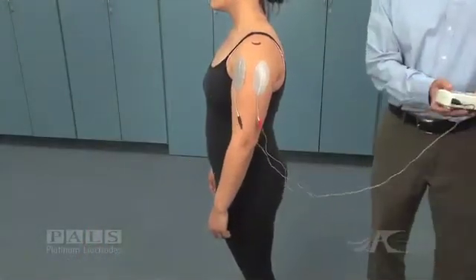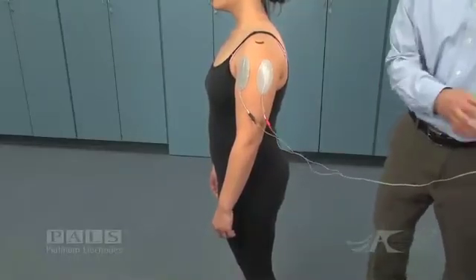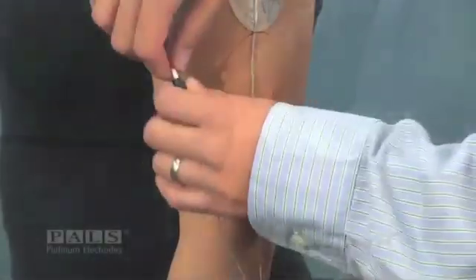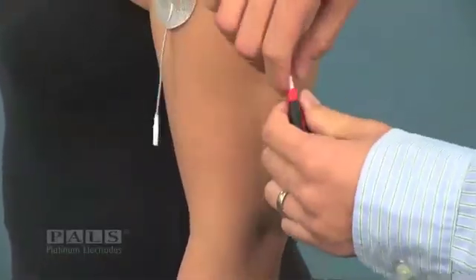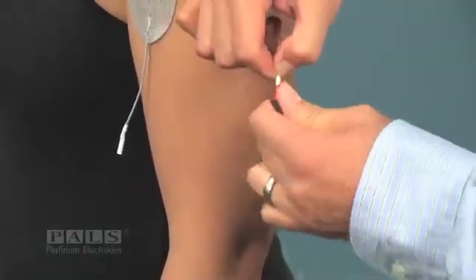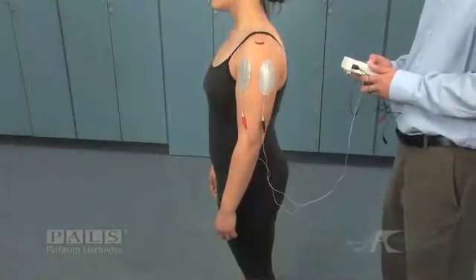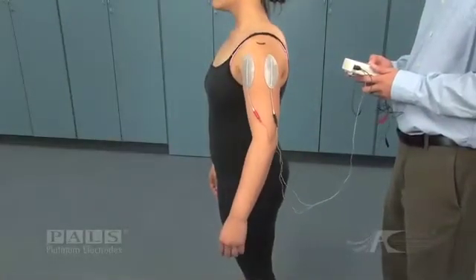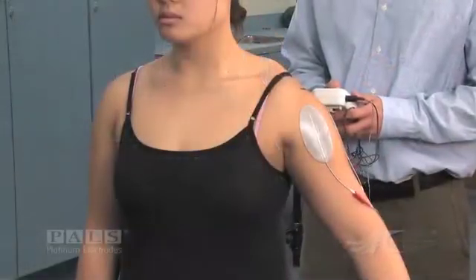The therapist is now putting the stimulator on pause and he's going to switch the polarity, so that the middle deltoid electrode is now the negative electrode and the anterior deltoid will become the positive electrode. You can see the resultant stimulated contraction is one of dominant abduction.